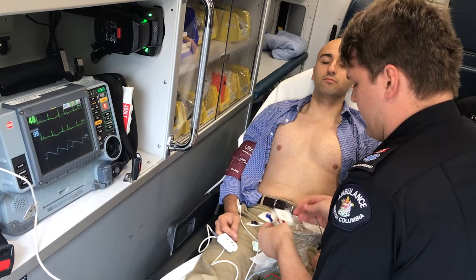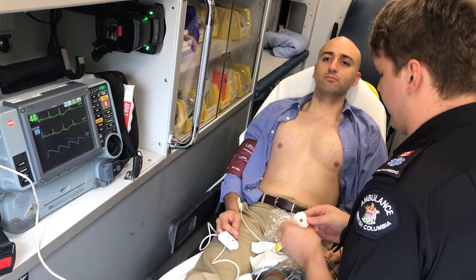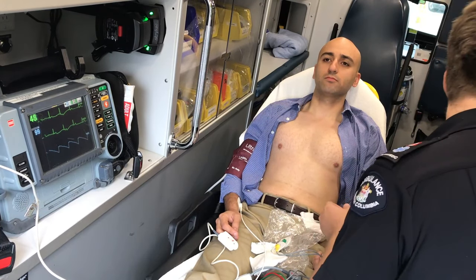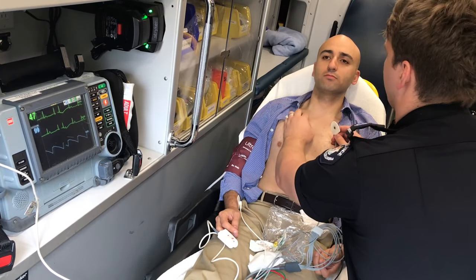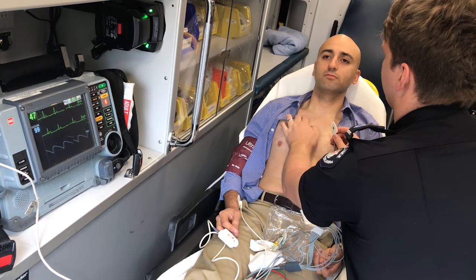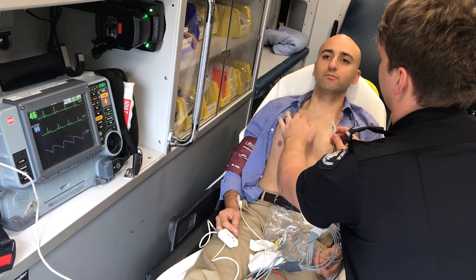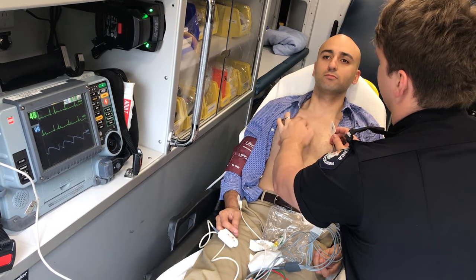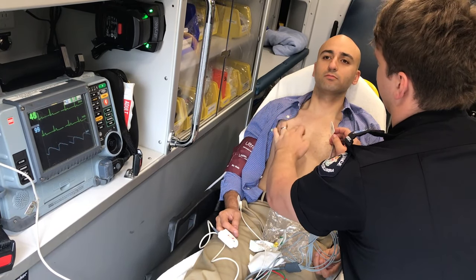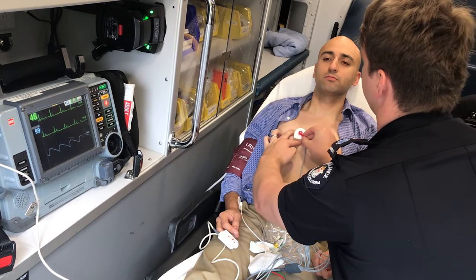Going back, starting with V1. Just right lateral of the sternum for the 1st, 2nd, 3rd, 4th intercostal space.